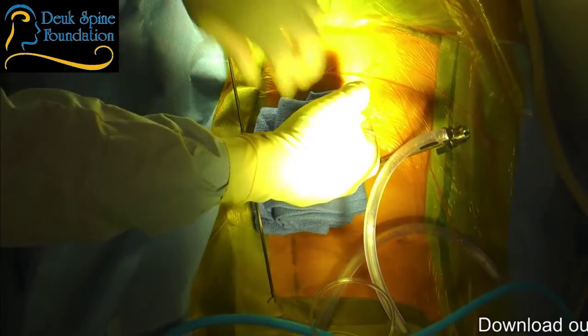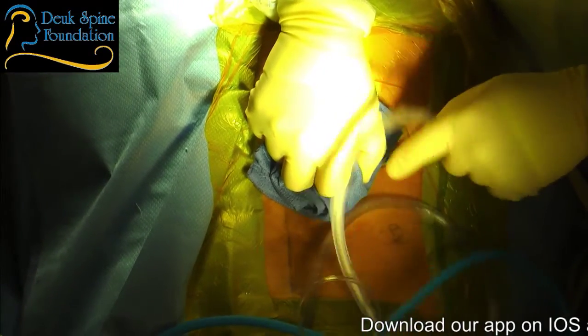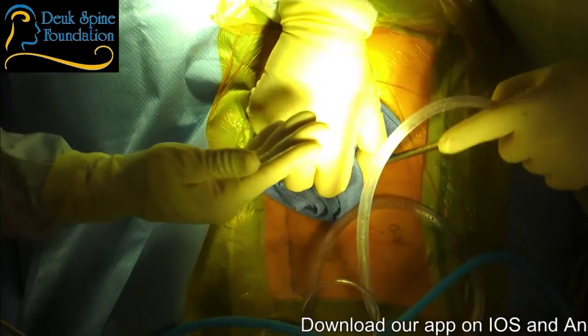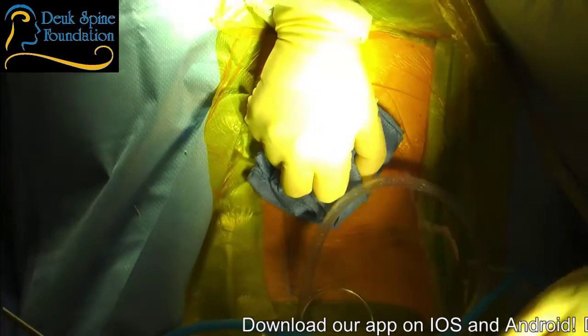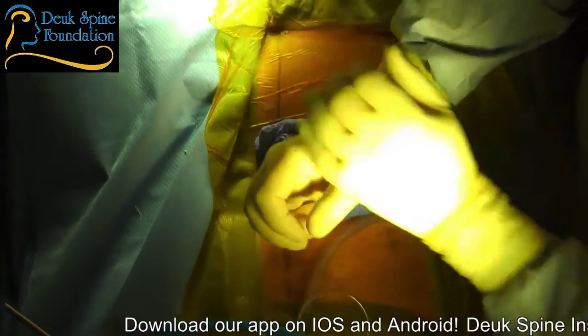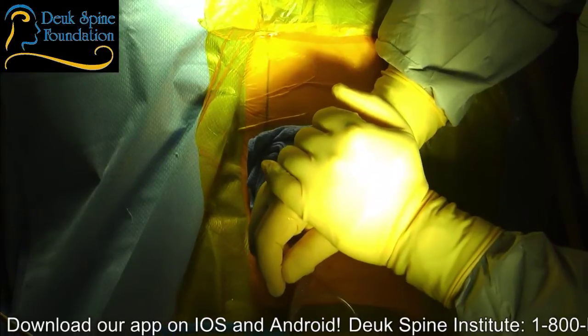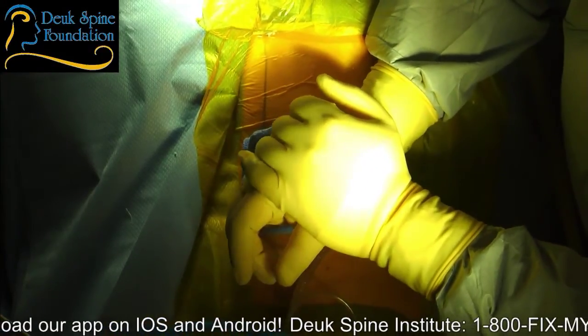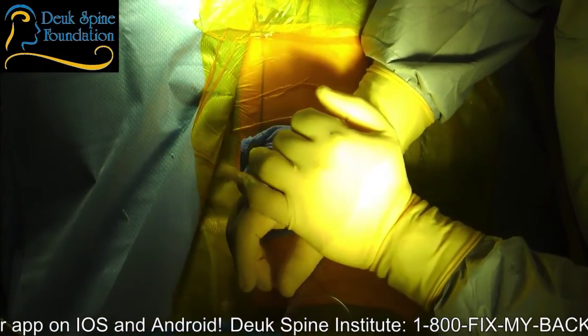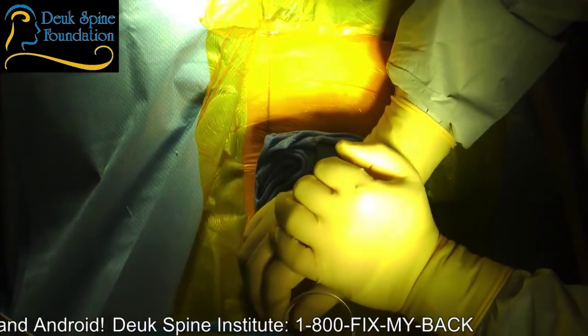So we're going to get Dr. Patel in here next, who's going to do a rhizotomy on the facet joints. It's kind of a combined procedure. The rhizotomy will treat facet pain. What I just did, what you watched, the Deuk laser disc repair, fixes disc pain, which is what this patient primarily has. But just to be sure, we do a rhizotomy to take care of any facet pain as well.